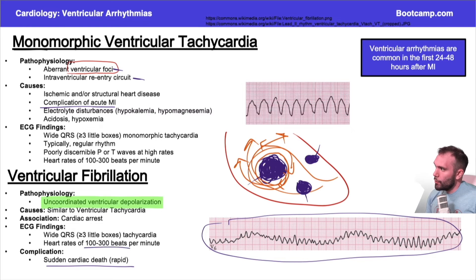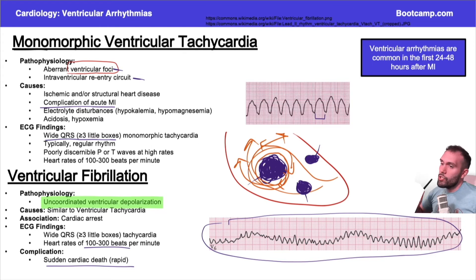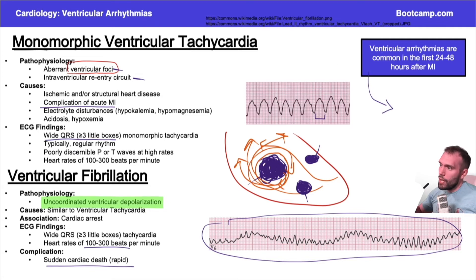Both ventricular tachycardia and ventricular fibrillation involve very high heart rates and are going to be wide QRS tachycardias — that's different from SVT. You can see this QRS is way more than three little boxes; we have probably seven or eight little boxes just making up one QRS. Now theoretically, on a board question, if a patient has a ventricular arrhythmia 24 hours after their myocardial infarction, what antiarrhythmic do you want to use?